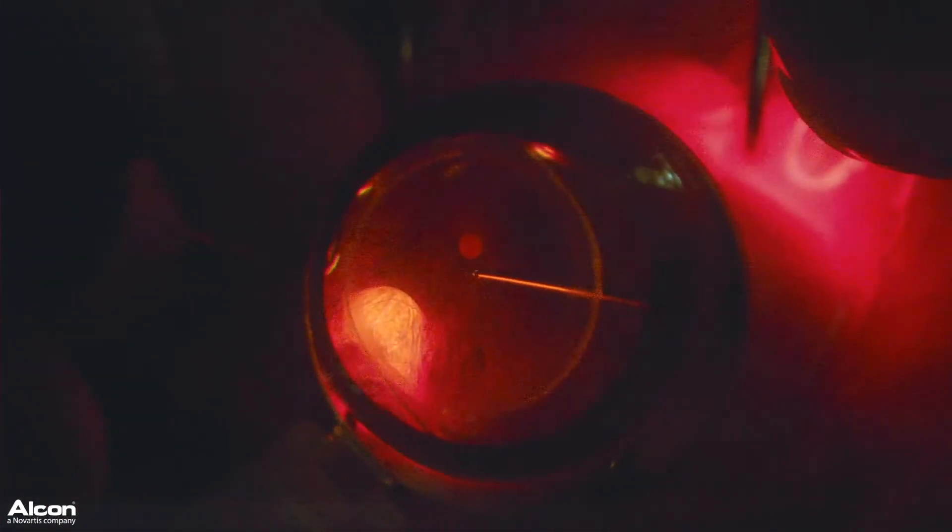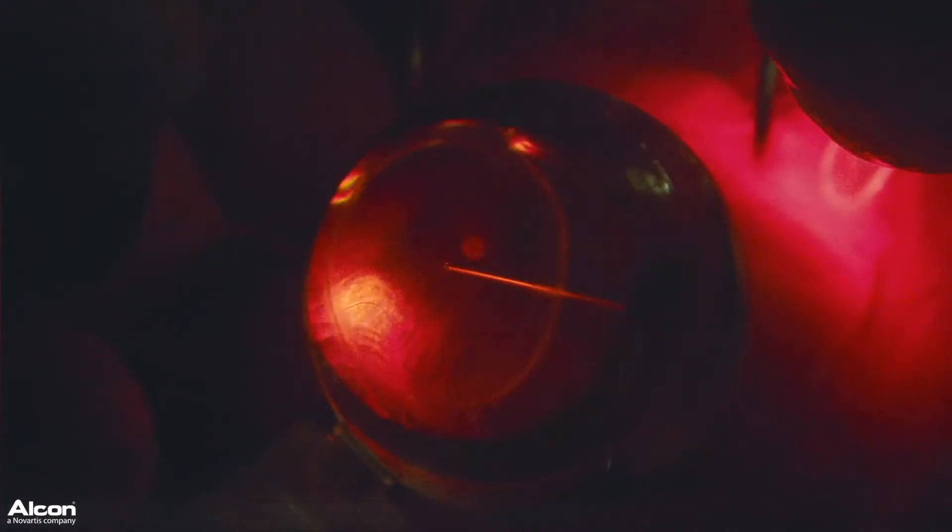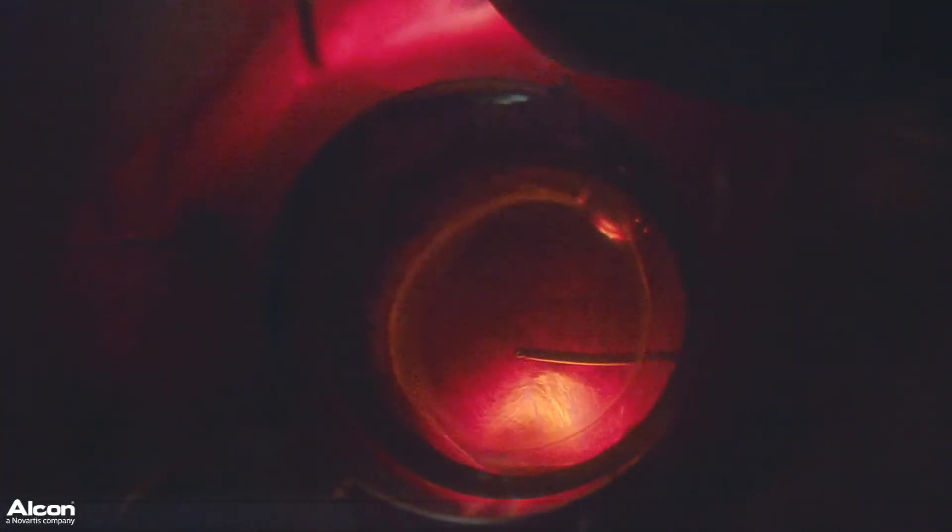Here, I'm using this light pipe guard, and this was made by Dutch Ophthalmic and included with their EVA packs, and I'm using it to provide transcleral illumination.